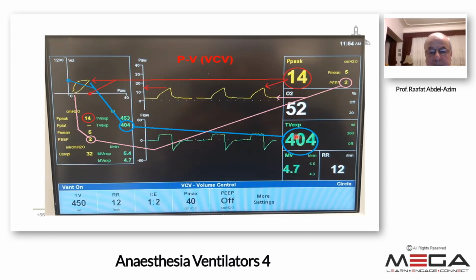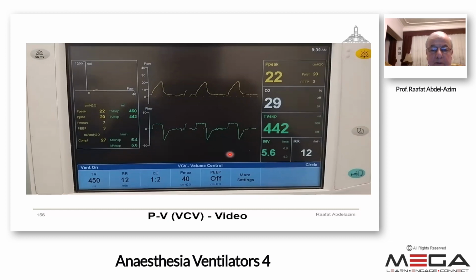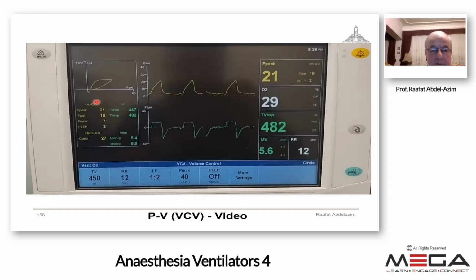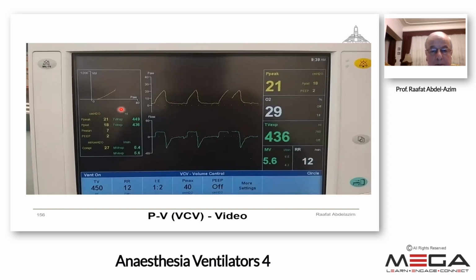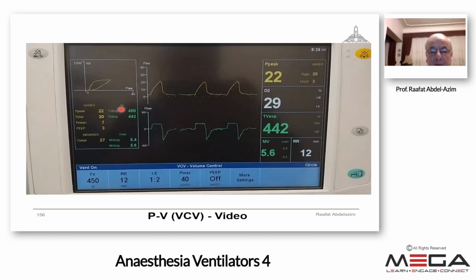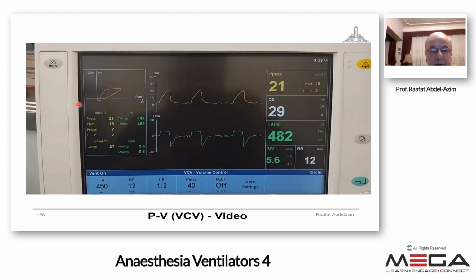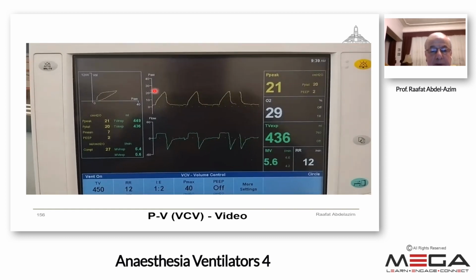The tidal volume, the expired tidal volume, is displayed here. We can see it here also on the loop. When we go to the highest point, what is displayed is the 400 value. Now we'll see this in the video. See the loop. Again, you see the changes here are the same here. Inspiration going up, expiration going down.